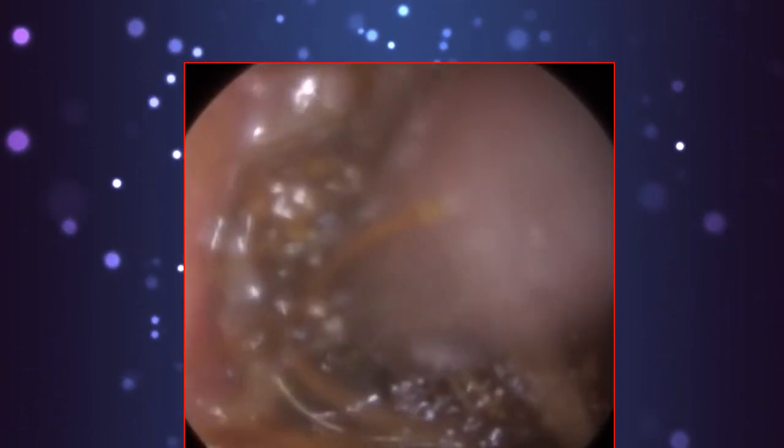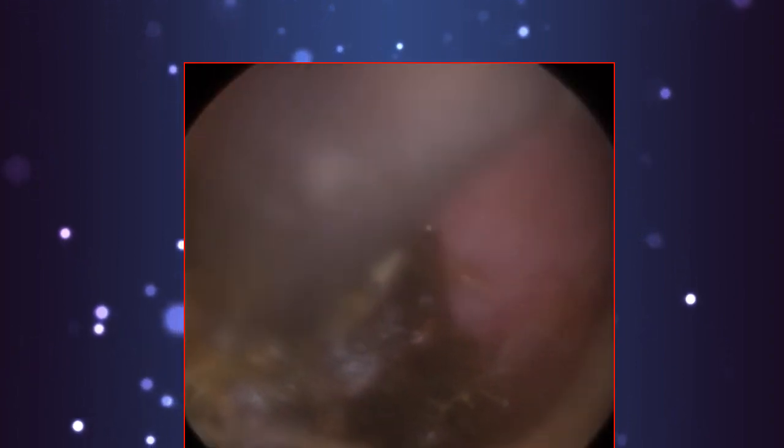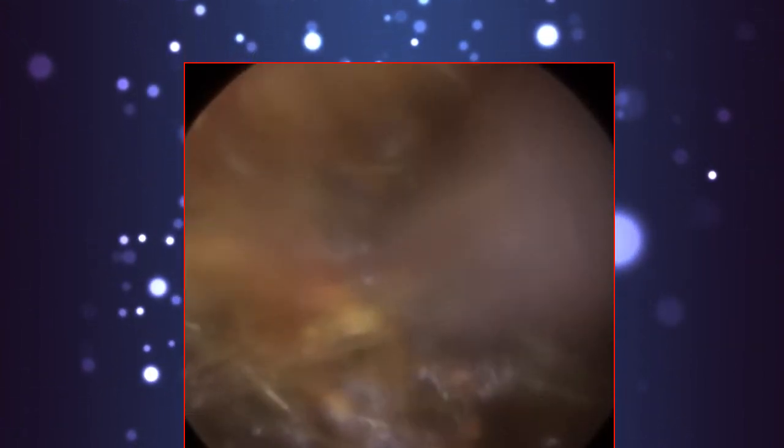So just going back in. See, in the UK, audiologists, currently at least, are not allowed to prescribe any topical lidocaine, which is a local anaesthetic, which is what some ENT doctors use. And sometimes you can also inject a bit of lidocaine at the back of the ear as well to numb it. And slowly but surely manage to get this out.